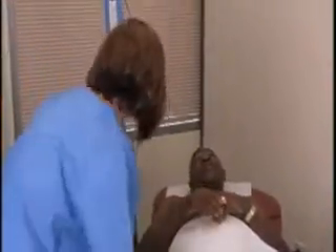Remember the following points when preparing a patient for an ECG. The patient should be relaxed and in a comfortable supine position with the legs and arms supported. Keep the patient warm to avoid shivering and or muscle tension, as this could create noise that may interfere with the ECG tracings.